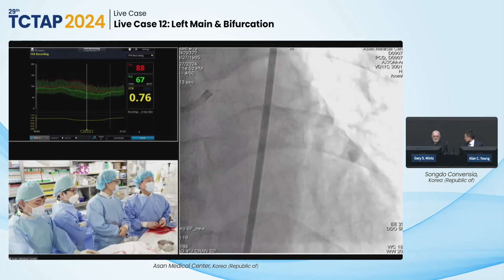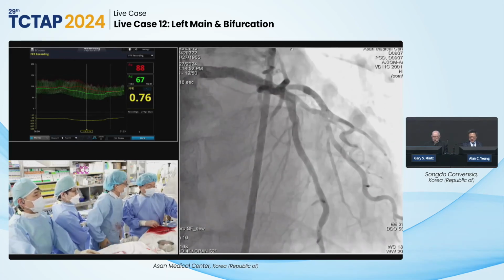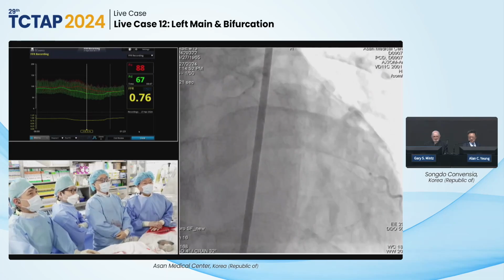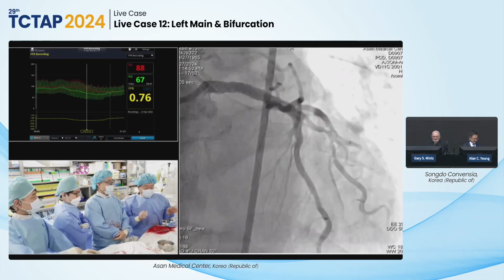Right. So anyway, what do you want to do? Gary's just thinking, one minute, limited time. He's shaking his head. Well, I don't know what it means. We decided just to leave it alone. All right.